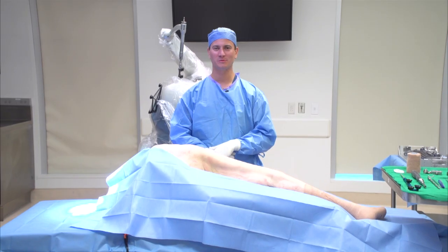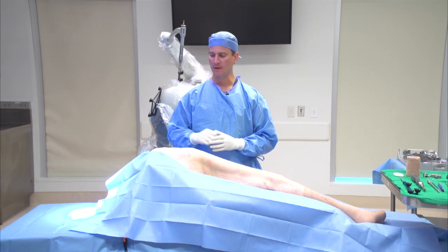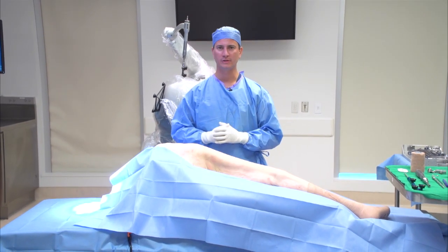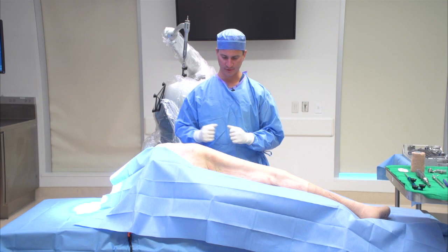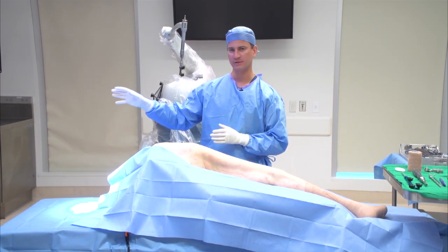Hello, I'm Seth Drobick from the Hospital for Special Surgery, and today we're going to be demonstrating a posterior lateral Mako total hip replacement. Before we get started, I'd like to orient you to the operating room. We currently have a patient positioned in the lateral decubitus position with the right hip up. The head of the bed is in this direction.